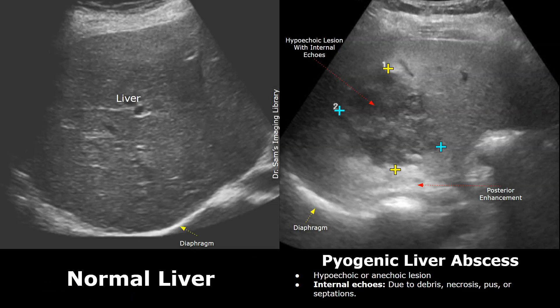We will compare the normal ultrasound appearance of the liver with the appearance of the liver having an abscess. The normal liver has a homogeneous echo texture, meaning the echoes are evenly distributed with no patchy or irregular areas. It appears as a smooth, uniform, medium gray structure. This bright curved structure is the diaphragm.